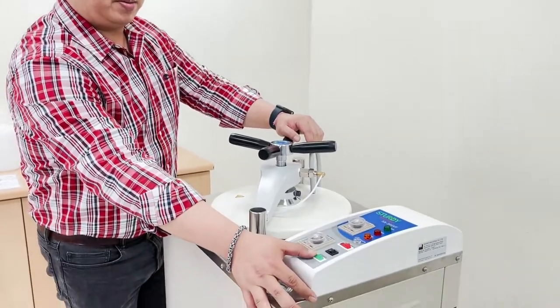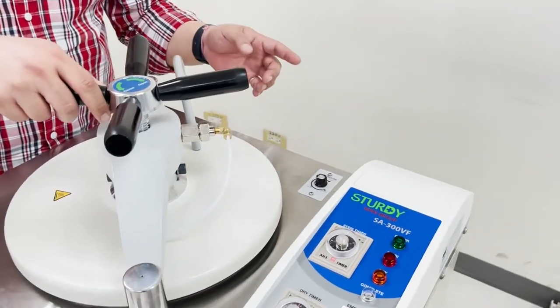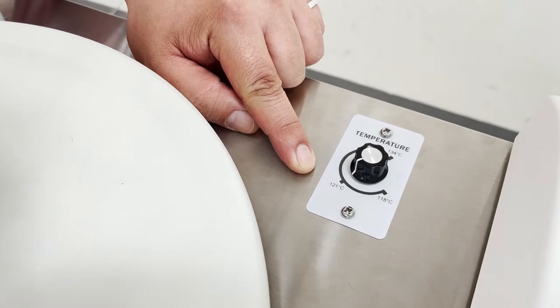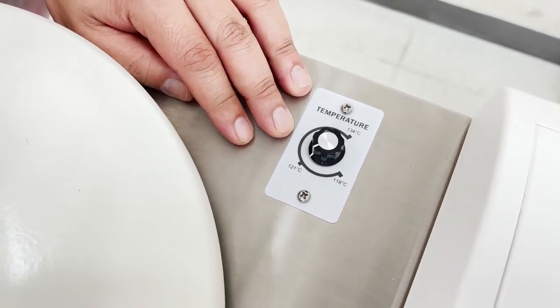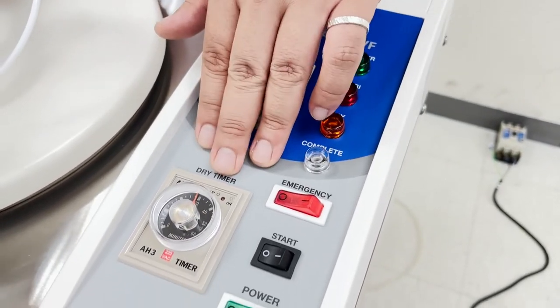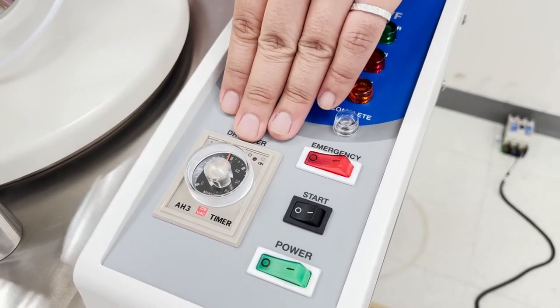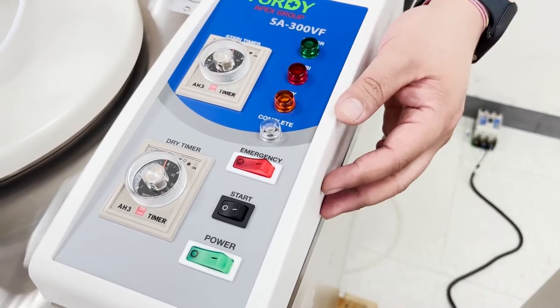Once the chamber door is sealed, switch on the power. Adjust the sterilization temperature — there are three options: 118 degrees Celsius, 121 degrees Celsius, or 134 degrees Celsius. Let's set it at 121 degrees Celsius. Next, set the sterilization time from 0 to 60 minutes — let's set it at 30 minutes. Moving on to the dry time, set from 0 to 60 minutes — we will leave it at 30 minutes.